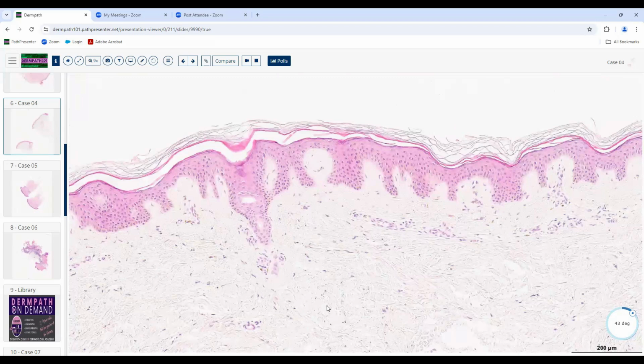A nodular amyloidosis can appear like a large pink nodule, often submitted as rule-out basal cell carcinoma. It's often on the head and neck area, and that is not always associated with the systemic amyloid condition, but you need to work the patients up. So if they have a large plaque of nodular amyloidosis in the skin, it may just be totally coincidental, but you need to make sure they don't have a systemic amyloidosis that's causing that deposition when it's more of a nodular pattern. This pattern, you do not need to work it up.